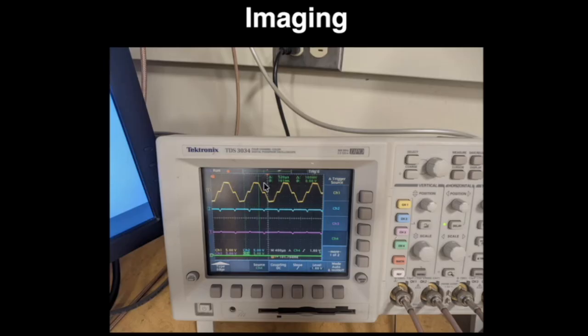It's like half of the time of that transition between when you're done reading one lobe to the end of reading the next one. So you see that difference here is about 520 microseconds. So it's half a millisecond. But you're spending about half of that, about 200 microseconds, just switching from reading one direction to another. You have 60 lines of data in your image. That's 12 milliseconds you've just wasted switching gradients.